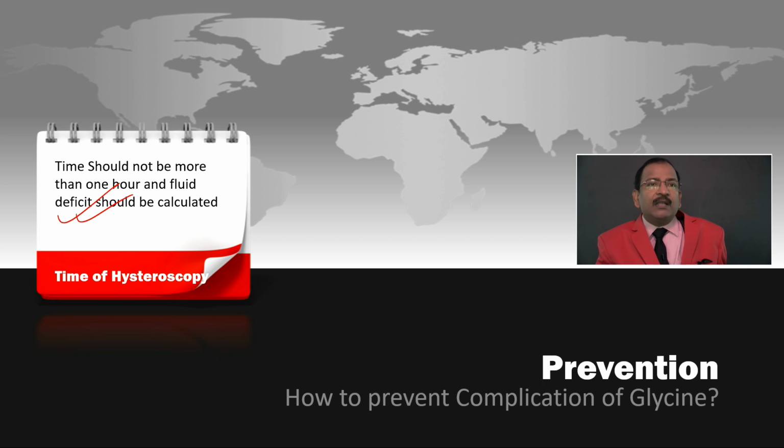Another, it may go intravasation, meaning into the vessels. And third is leakage onto the table and the floor. That's why leakage is not good, because it will be uncounted. How can you handle it? You have to wipe up all the fluid on the floor, collect it in a bucket and then measure. So you should be careful that if the fluid deficit is more, you should stop the surgery.